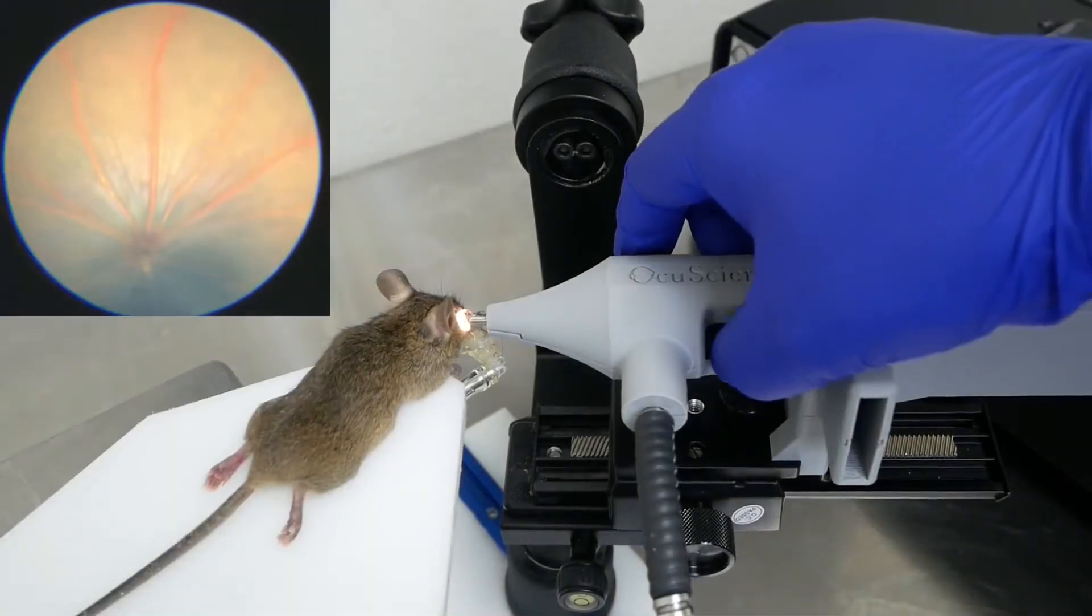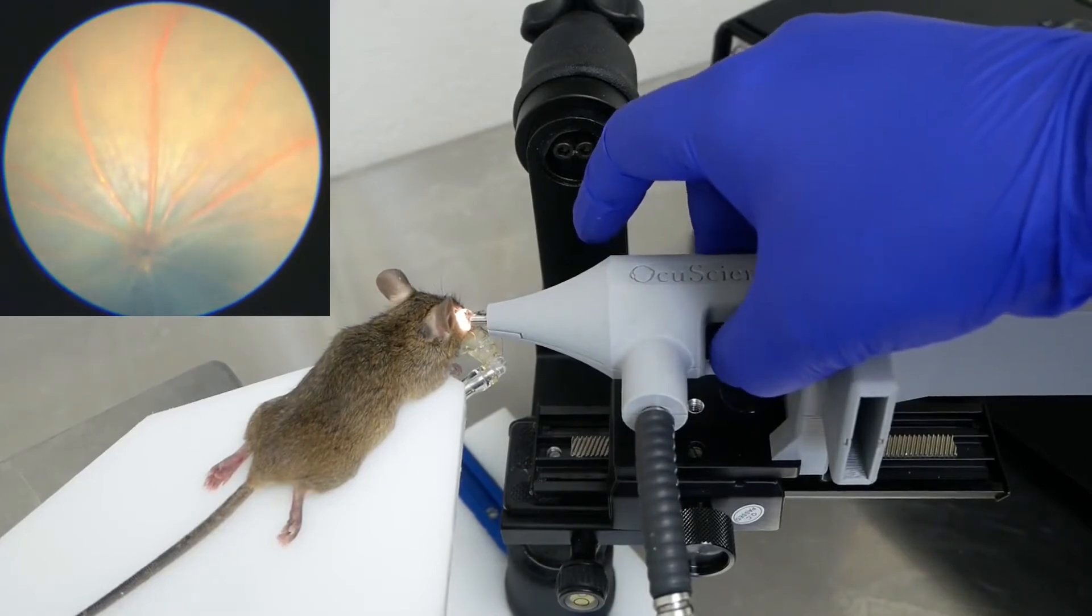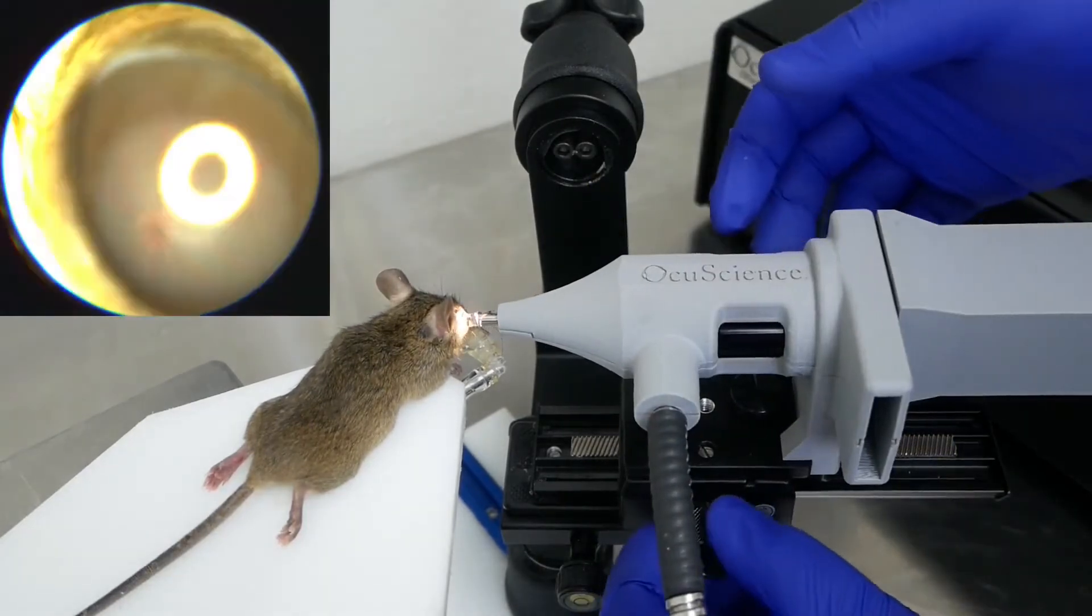Aligning the scope and the rodent eye is simple to learn, and with the twist of a single knob, you can quickly bring the imaging focus from anterior to posterior.